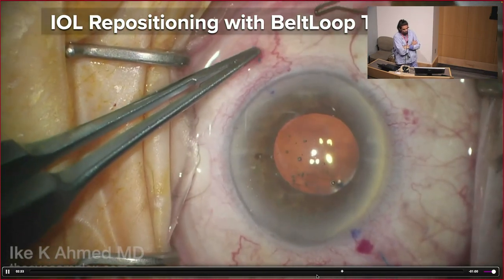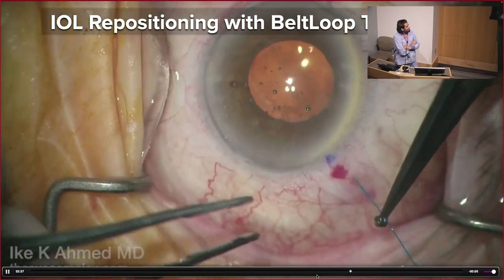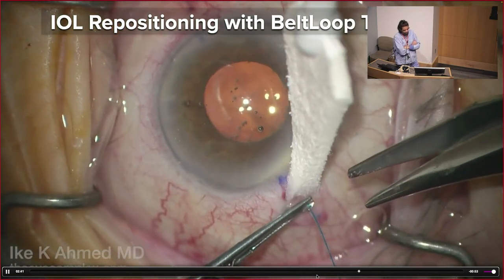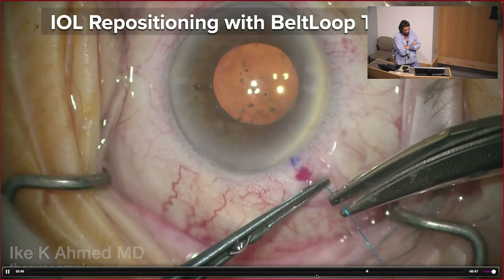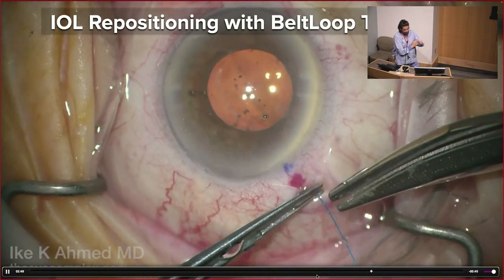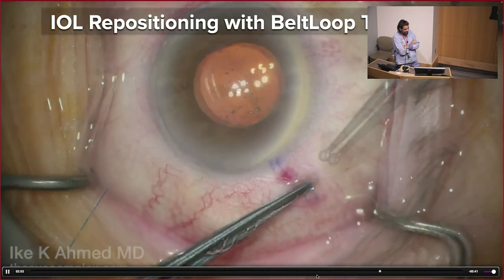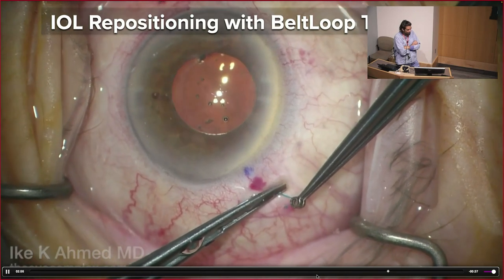Tense it so the lens comes towards you. Then we push the suture back, and it gets back into position. That over-tensioning or snapback approach helps us visualize. It is subjective though, and that's why it does take a bit of art for this. You see, we're pulling the lens over toward us, imagining how much we need to pull out, and understanding that of course melting the end will shorten that knot as well.